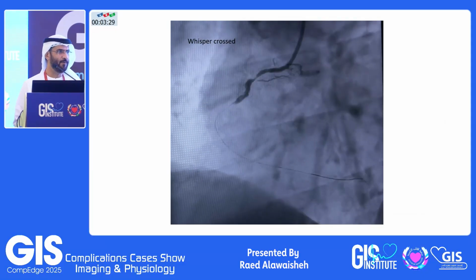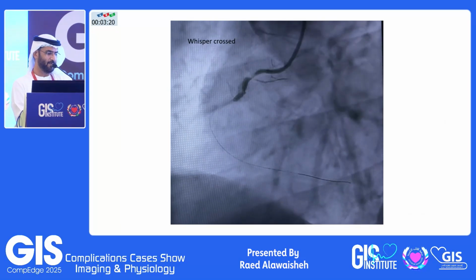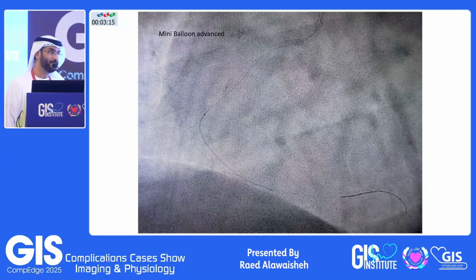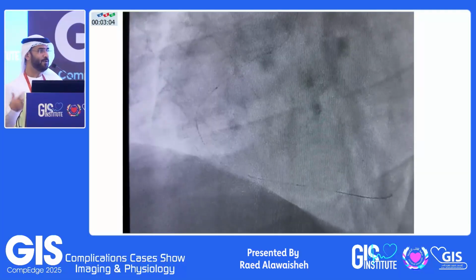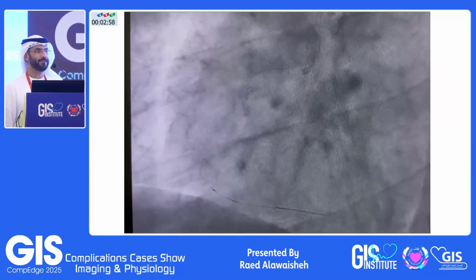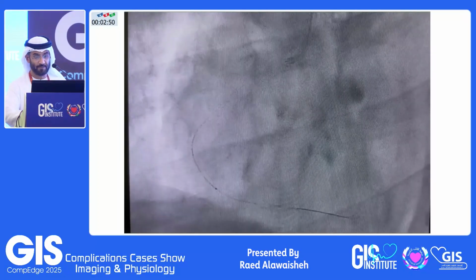Who is happy about the distal wire movement? Well, it could be in the pericardium, yes, but it could be not. I cannot say, but most likely yes. So what he did, he put a balloon, a short balloon, just to cross the region. Pushing it hard, without looking at the distal wire, how it behaves, then, oh good, the balloon crossed. He's happy now, because he achieved his aim. He wants just to cross the region, not looking at the distal wire or where the wire should be.